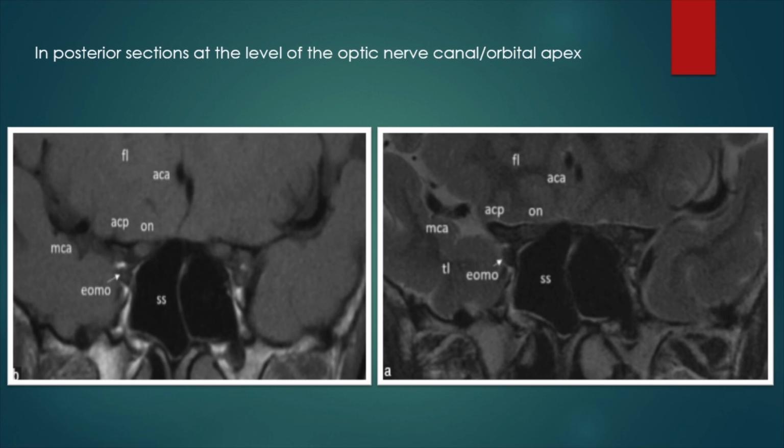Intracranial is surrounded by CSF, no? Intracanalicular part. Yeah, so now tell me, where is the nerve? Just keep the cursor. Can you bring the pointer here? Yes, ma'am. So this is your intracanalicular optic nerve.